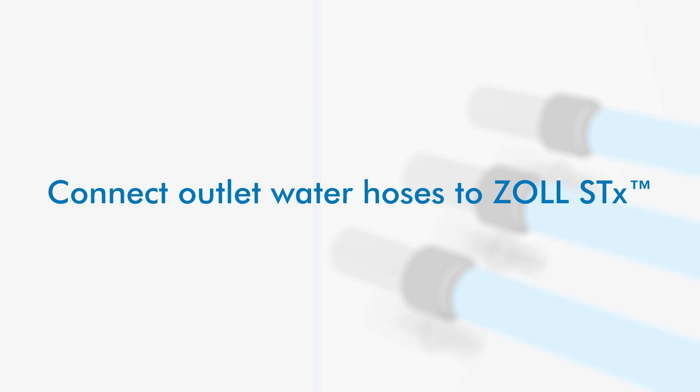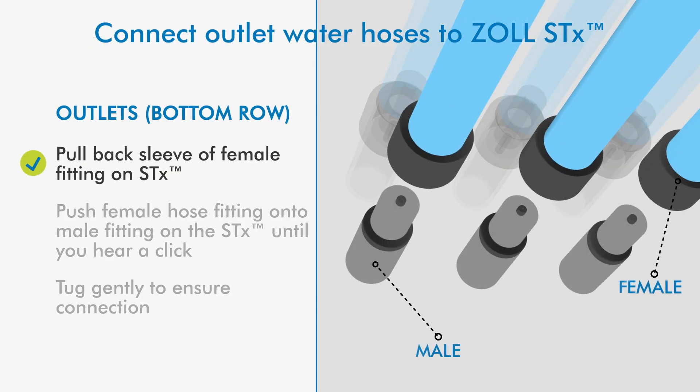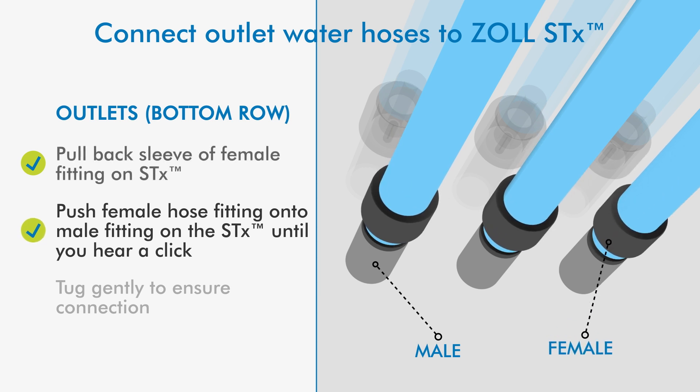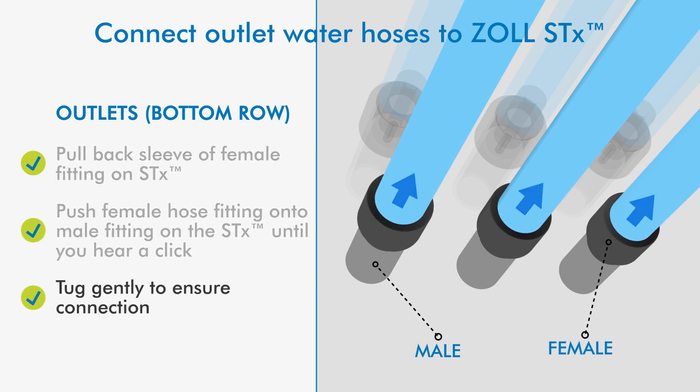Connect outlet water hoses to the console. Pull back the sleeve of the female hose fitting, then push the female hose fitting onto the male hose fitting until you hear a click. Tug gently to ensure connection.